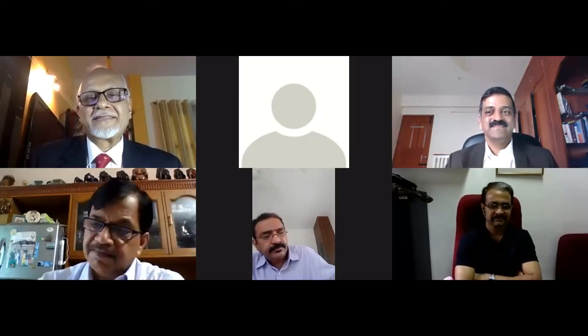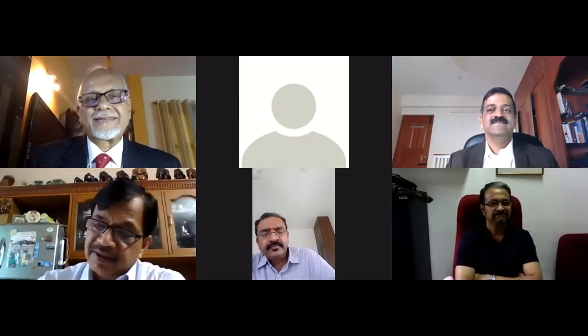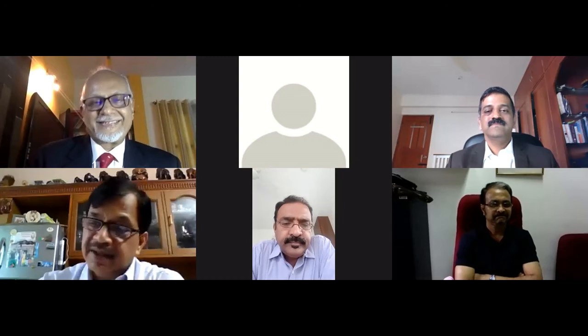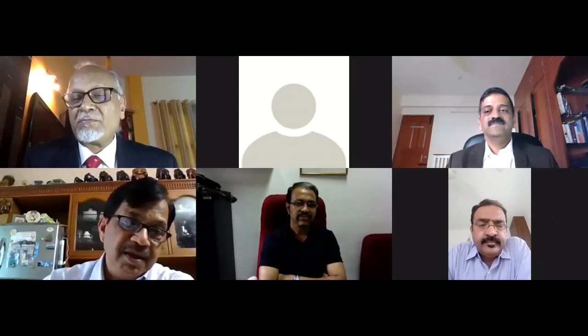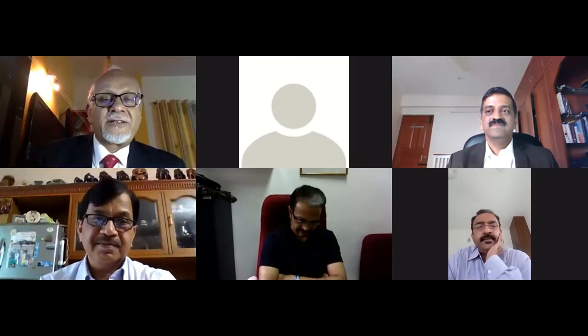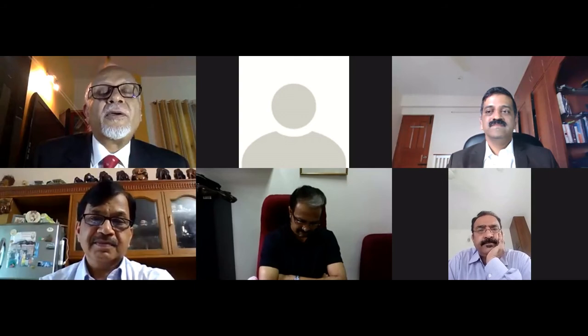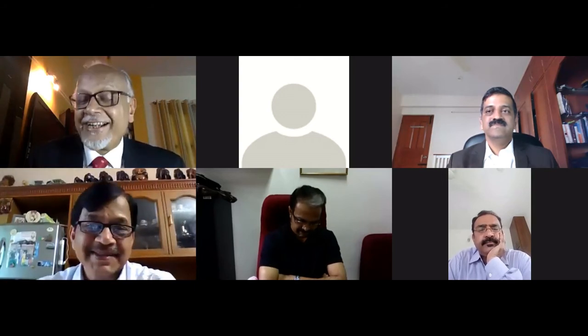Thank you, Subhash. I think I have one quick question to Dr. Nagaraj Desai. The first question that appeared on the screen was: P wave inversion, is it normal or abnormal? Inverted P waves. P wave inversion in aVR, it is normal.